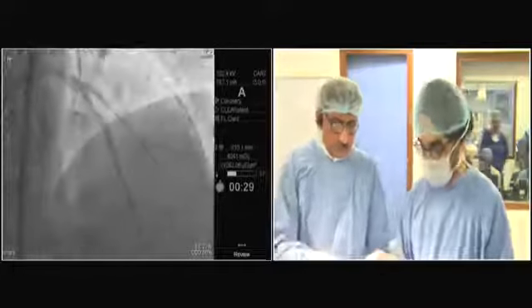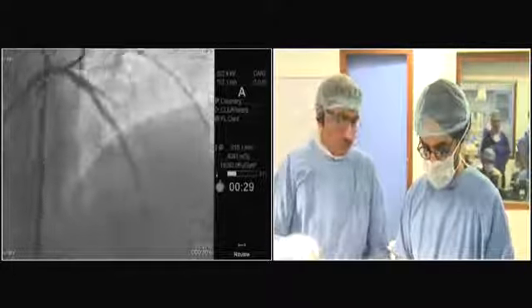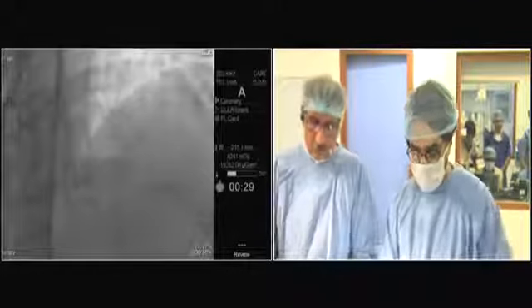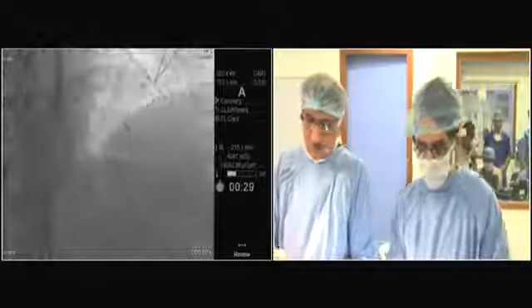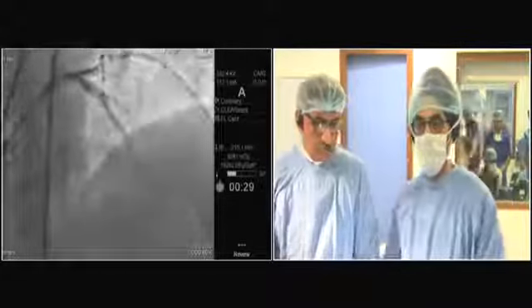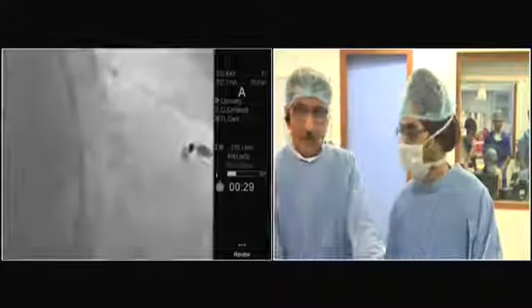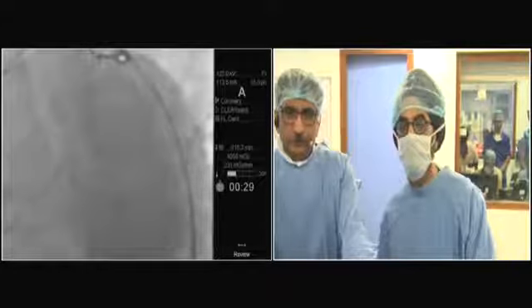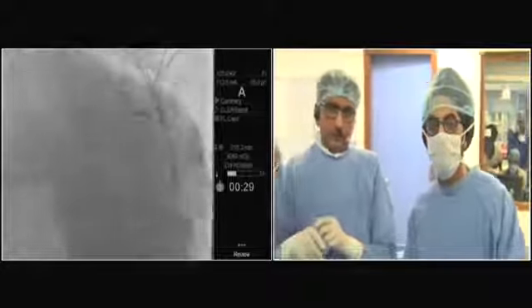David, is the remaining time 1 minute? Okay, so maybe 5 minutes. So you have 5 minutes. So I'll do the IVUS before we leave you. IVUS ready. So you have 1 minute only. So okay, let me take an IVUS.